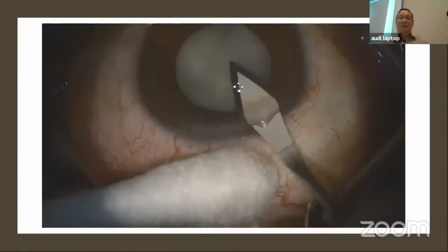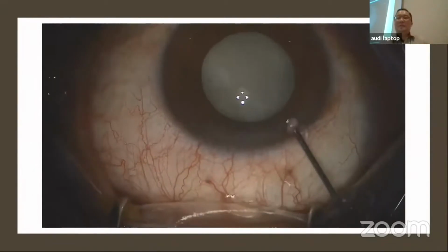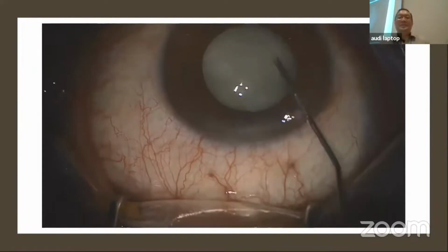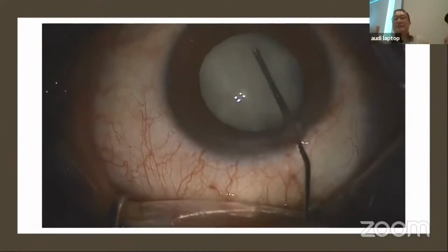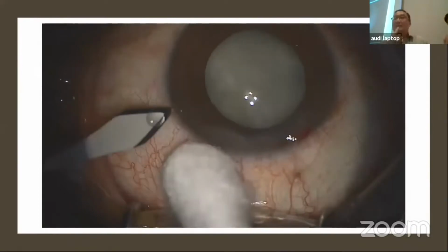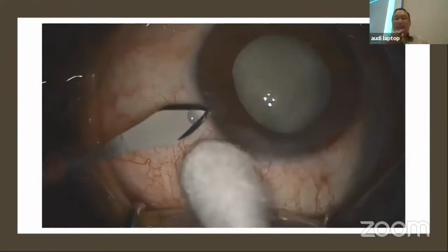Okay, pressing the wound. So you see collapse. So what do you do? OVD. Okay, you see afterwards. OVD first. Okay, it's a reflex response. So we need to form the AC in order for him to do the second part. Okay, it's correct, but it's not OVD.